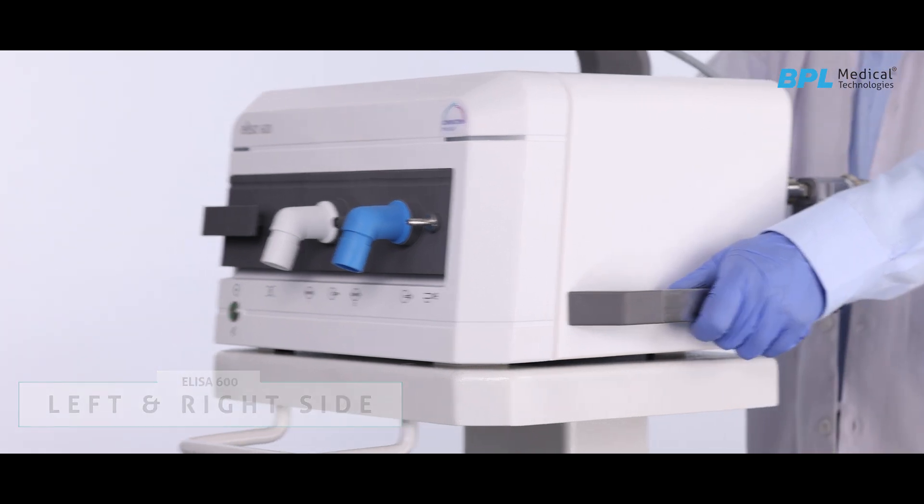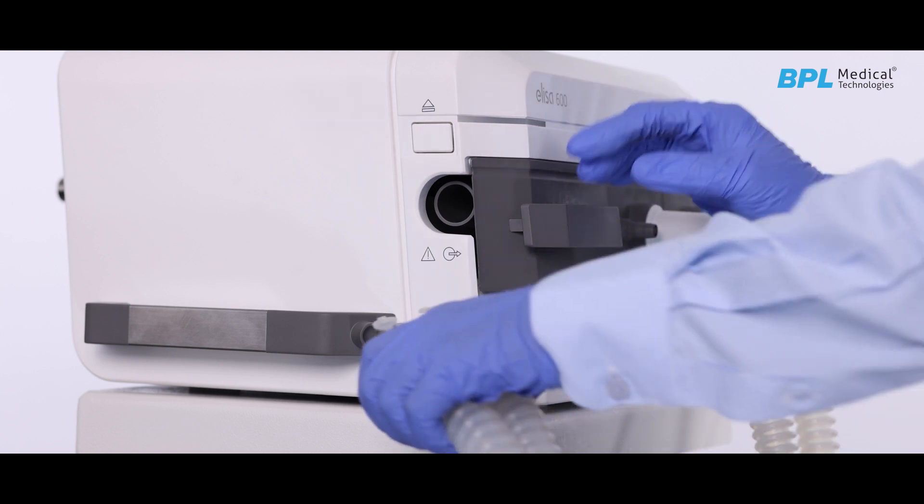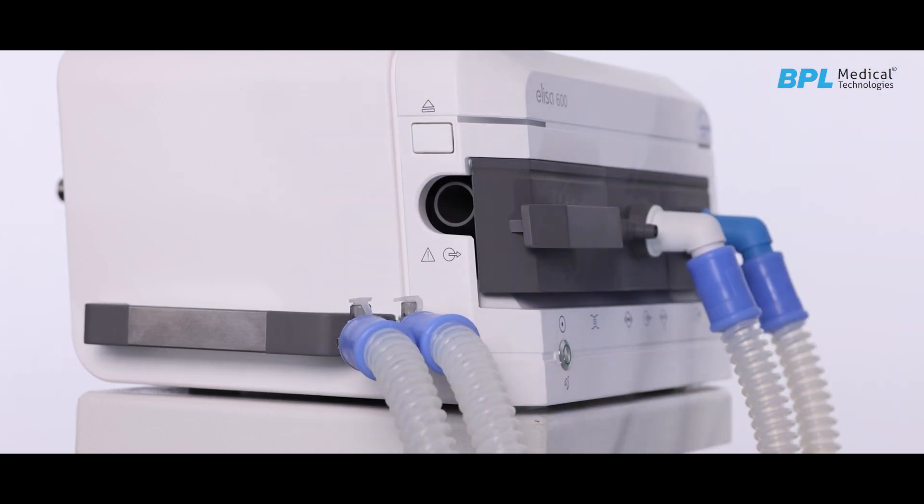Maneuvering handles are provided for maneuvering the machine. A Y-piece blocker eases the blocking of the breathing circuit and patient circuits Y-piece during the system test.